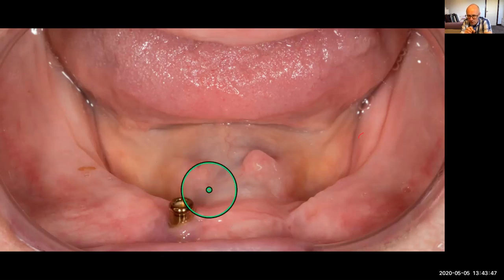There's some good research to show that even one implant in the lower helps to improve a patient's quality of life. There are some good German studies where they've just put one in the midline and it's worked beautifully. And I find that they work really nicely here. So we didn't do another implant, we just kept that as it was, but we made one of these superbly extended lower dentures. This was just after Rowan and I had been to Japan to learn from Dr. Abe about his suction denture technique, and I was experimenting with silicone impression materials here.